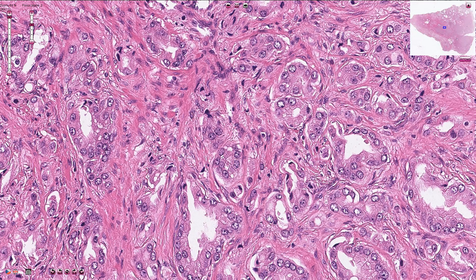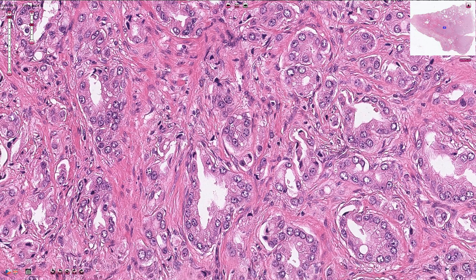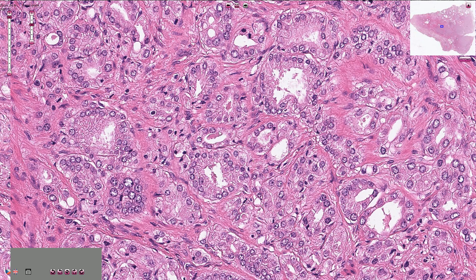The cells are very uniform and actually quite benign-looking, which is a paradox. The nuclei are typically round with prominent nucleoli. Prominent nucleoli — sometimes cherry-red, slightly eosinophilic, large nucleoli — is a very useful diagnostic sign. Another useful feature is the presence of crystalloids in the lumina of these small acini: those are the eosinophilic amorphous structures visible here and also here.